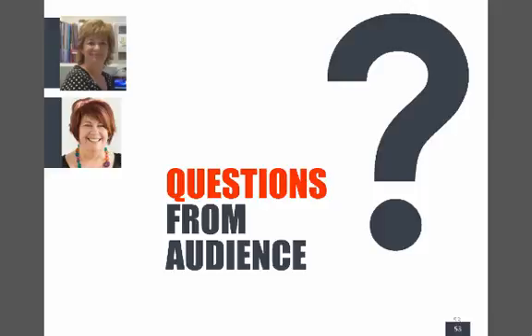Again, just while people are thinking, Lisa's very patiently been waiting for a question, which is around spirometry and the positioning in the person's mouth. Let me have another look so I make sure that I read it correctly. Yeah, I can see the question, Lisa, and it depends on the type of spirometer. Some spirometers you can breathe in through, and some you can't, because the filter in them will stop the person getting a full breath.